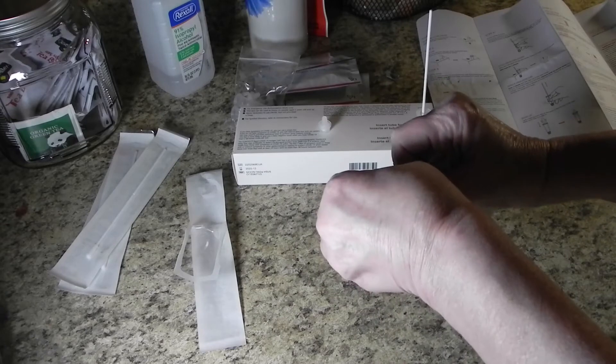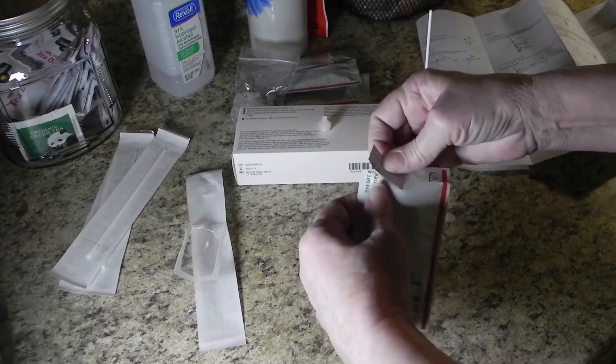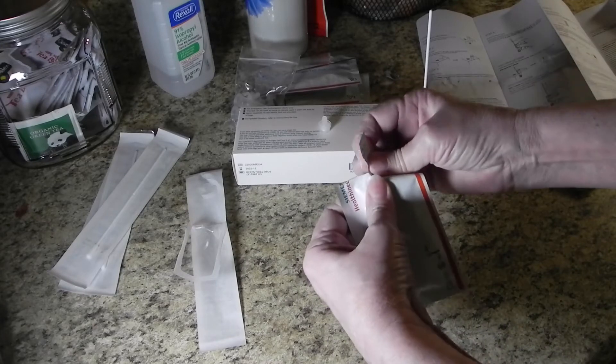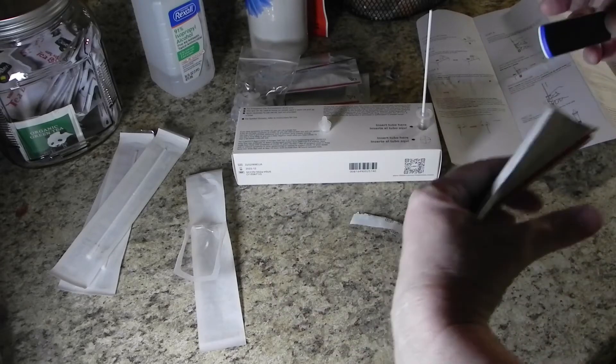While you're waiting for the one-minute timer, go ahead and open the packet containing your test cartridge. The only other thing in that package is a silica gel pack, which you can throw away.